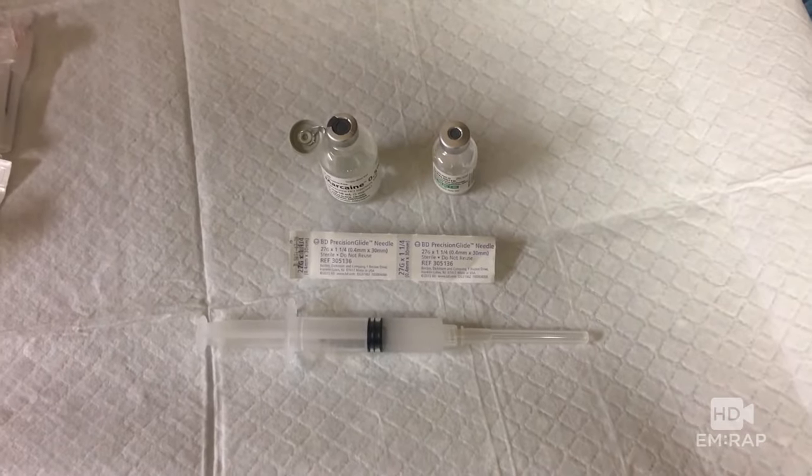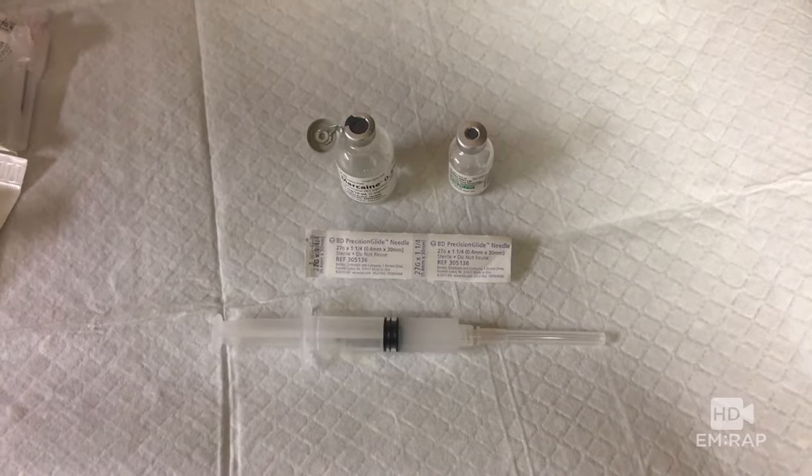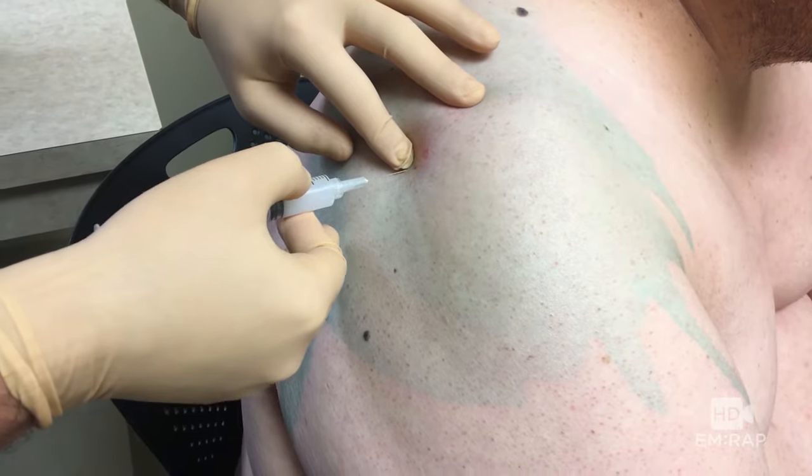Now you can choose your shoulder cocktail. You can mix either lidocaine or bupivacaine with some steroid, like methylprednisolone. You can repalpate your landmarks and then inject a wheal.